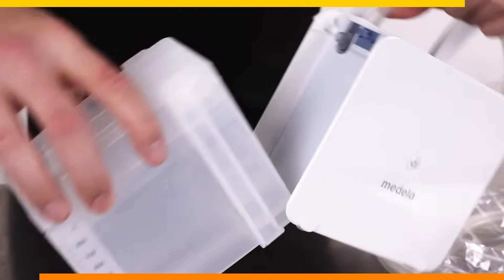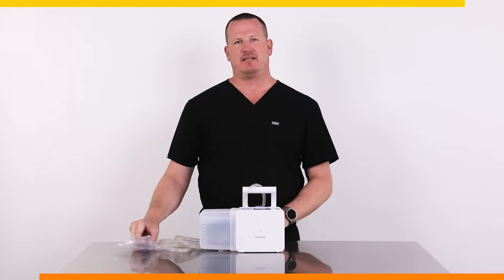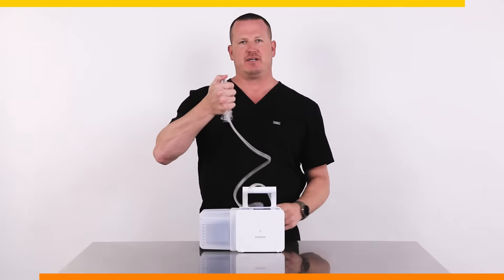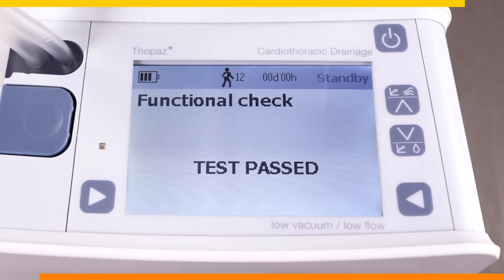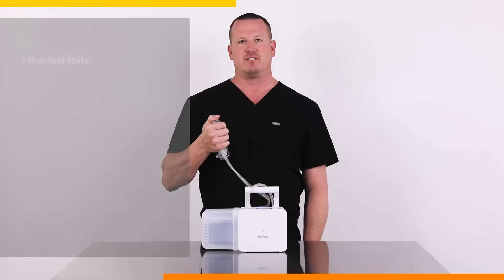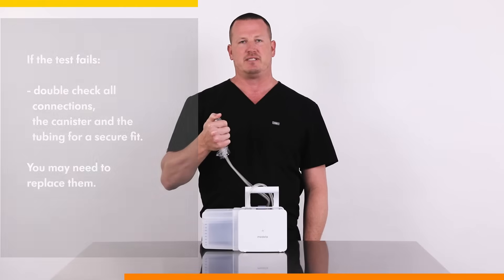If the canister size does not match, dispose of the canister and replace with a new one before proceeding. Under aseptic technique, place your finger over the end of the patient connector and press OK on the bottom right of the device to run the functional check. If you see the status test passed, the device is now in standby and ready to use. If the test fails, double check all connections, the canister and the tubing for a secure fit. You may need to replace them.